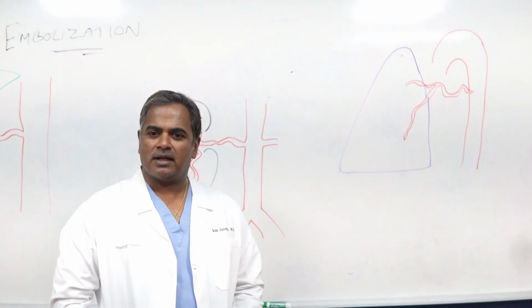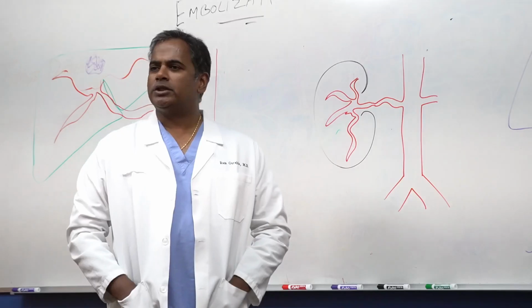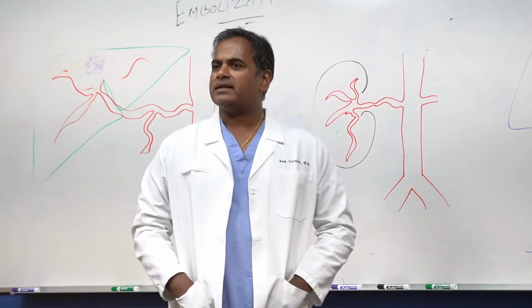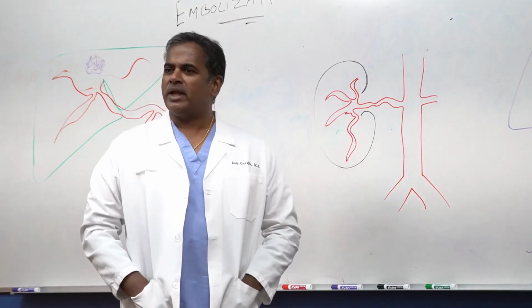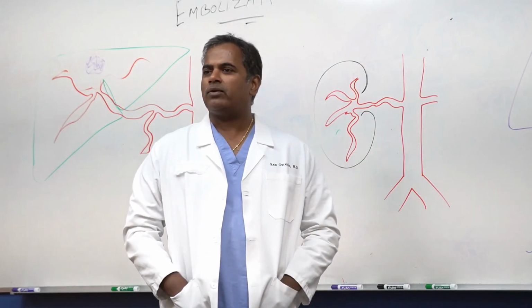In this session, I'm going to talk about a procedure called tumor embolization. Tumor means an abnormal growth of tissue, which could be cancerous or non-cancerous, while embolization means occluding a vessel to reduce or stop the blood flow into that vessel.